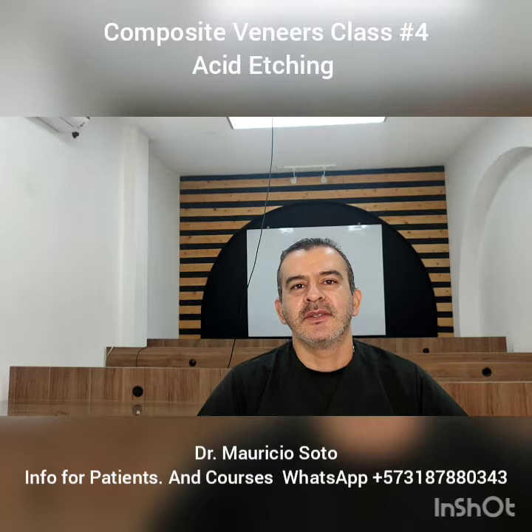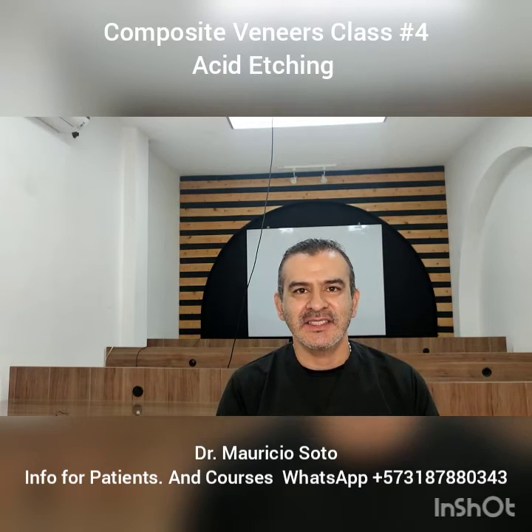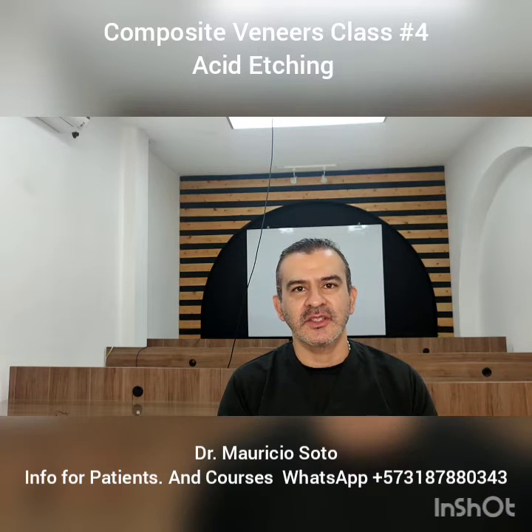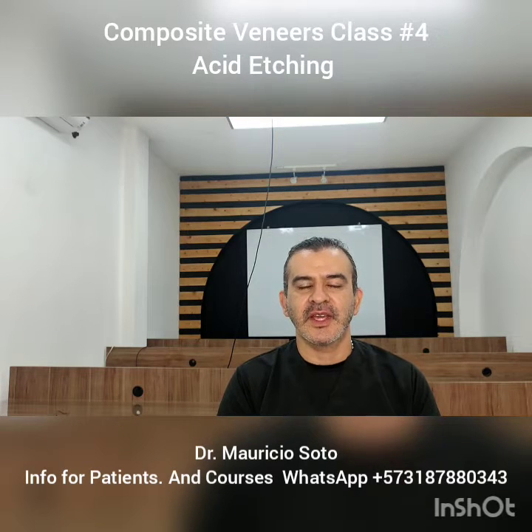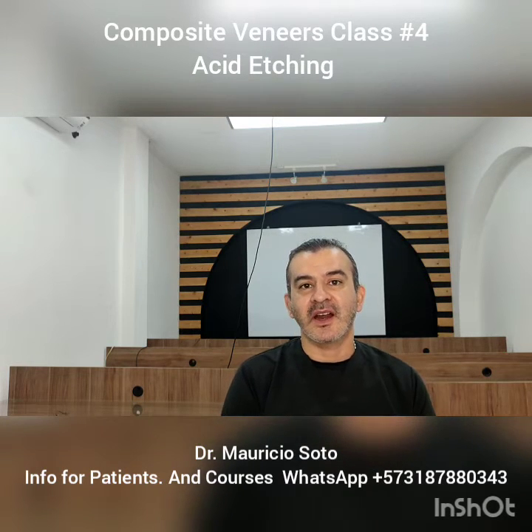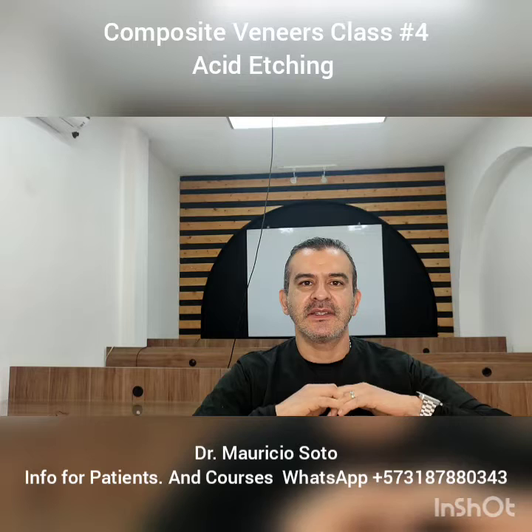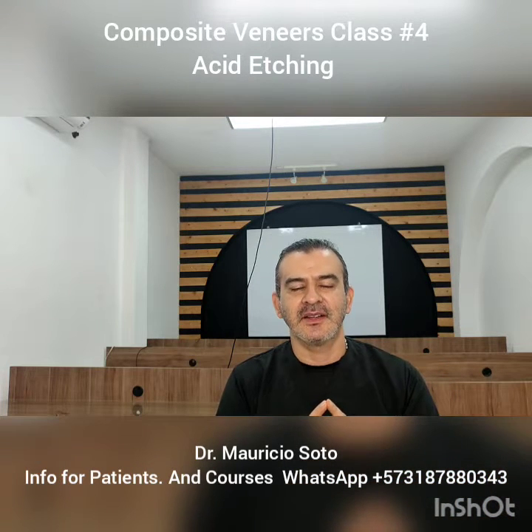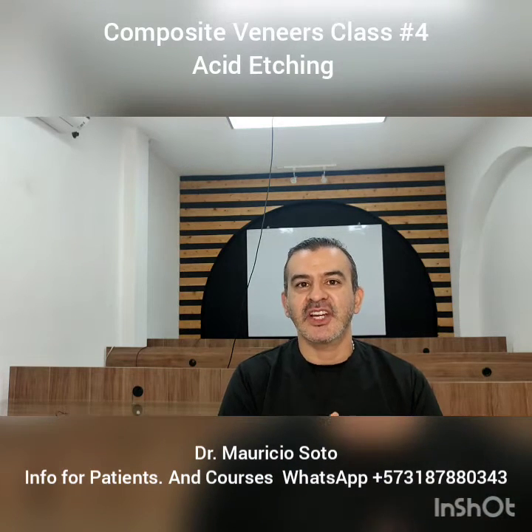Remember, the acid etching is an important step in the process of doing composite veneers. The acid etching creates microscopic holes on the tooth surface, on the enamel, for the penetration of the bonding agent. When the bonding hardens with the lamp, we have an interlocking between the bonding liquid and the holes in the enamel. The retention between the veneers and the teeth is mechanical.